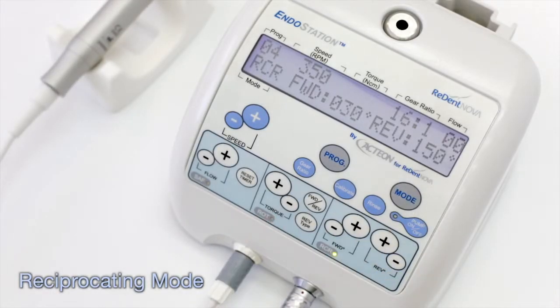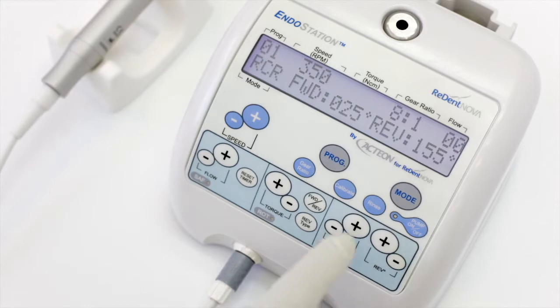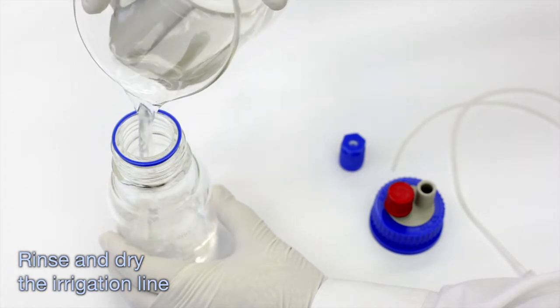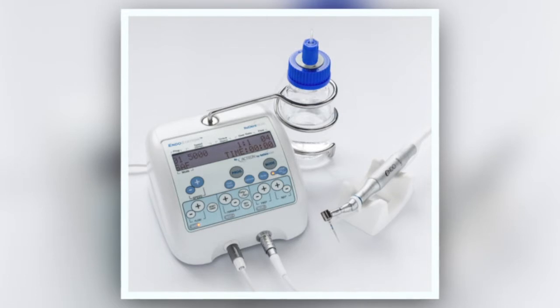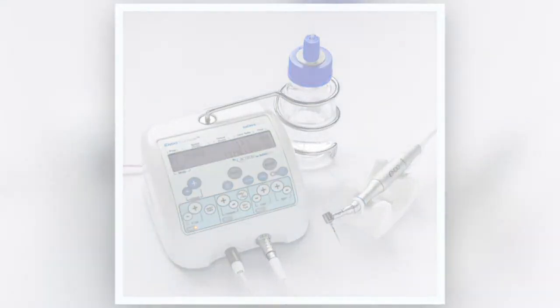For reciprocating mode, once the contra-angle has been connected and calibrated, adjust the speed and the rotation angles. To avoid clogging of the irrigation line, at the end of each workday, rinse the irrigation system by running clean water using the rinse key for at least 30 seconds, then dry by pumping air through the system. More information regarding the operation and maintenance of the endo station can be found in the Instructions for Use Manual.